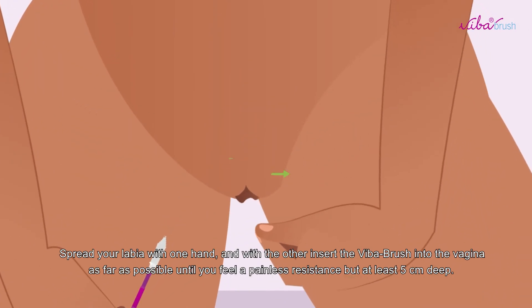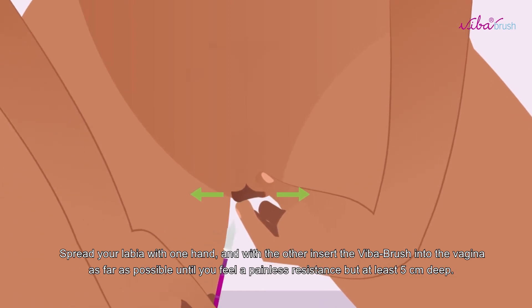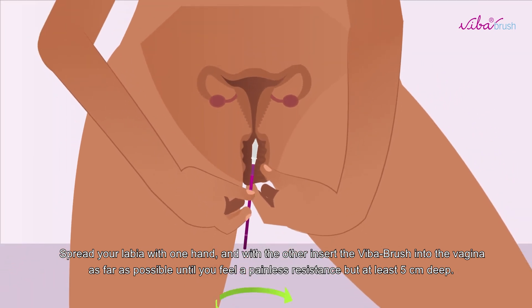Spread your labia with one hand and with the other, insert the Viber Brush into the vagina as far as possible until you feel a painless resistance, but at least 5 cm deep.